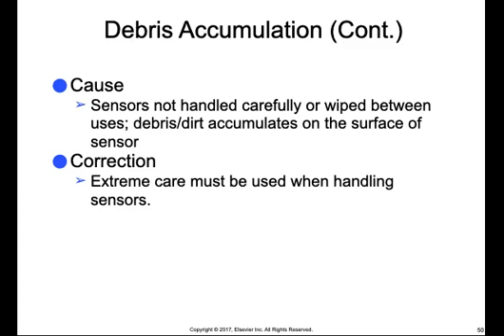So to correct for this, extreme care must be used when handling these digital sensors. These sensors are very expensive and they are not disposable, and therefore must be handled carefully between patients. Correct infection control procedures and cleaning off the sensors is important to prevent debris from accumulating or from scratching the sensor.